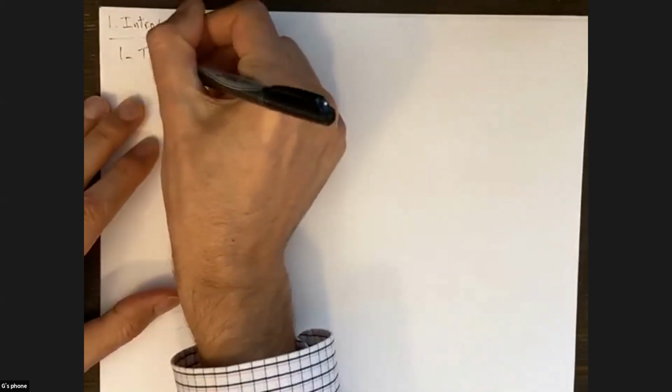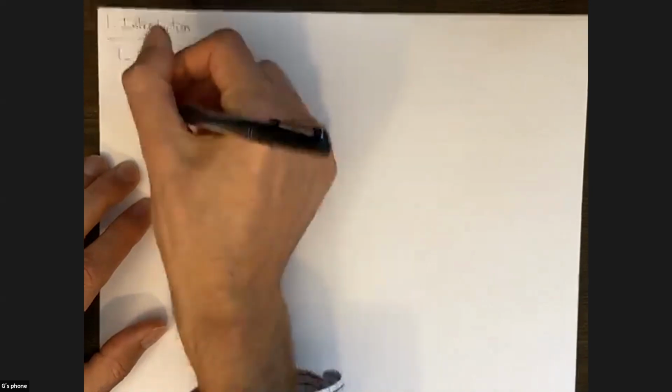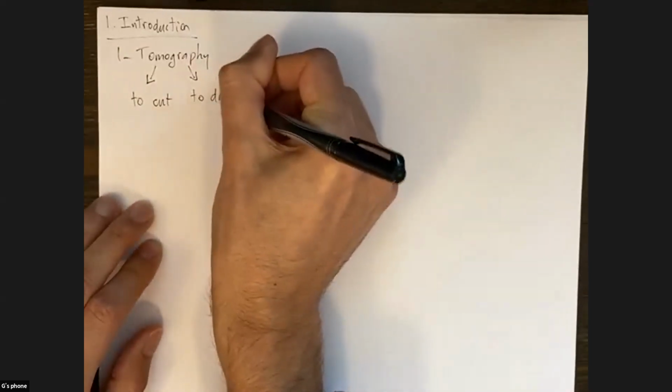I just want to introduce the concept of tomographic image reconstruction to you. First of all, we're going to talk about tomography, and this is a word you may not have heard before because it's not a very common word. Tomography comes from two Greek words, tomo, which means to cut, and graphos, which means to draw. So when people invented tomography, they went to Greek words and came up with that word, which means we're going to draw cross sections of something.